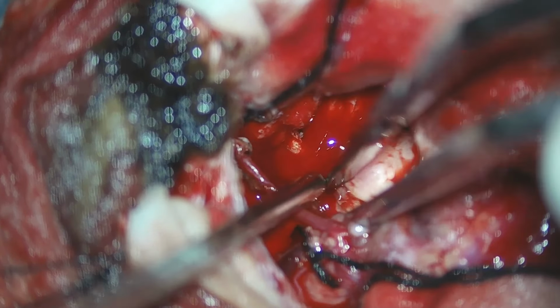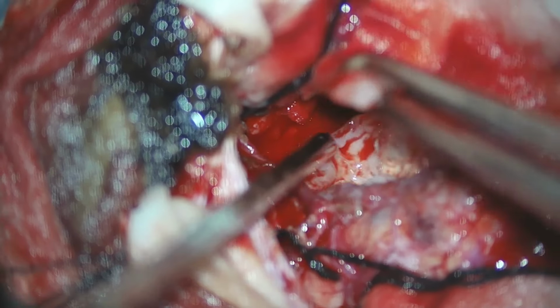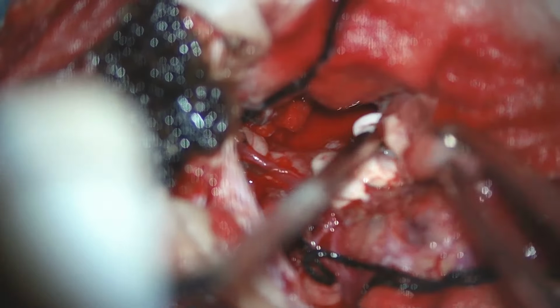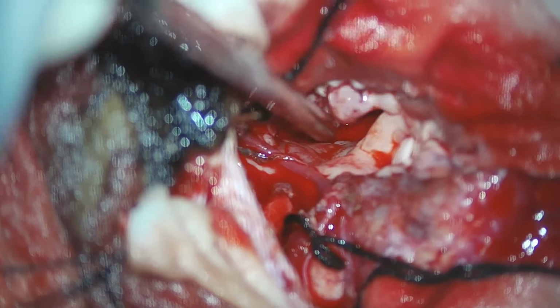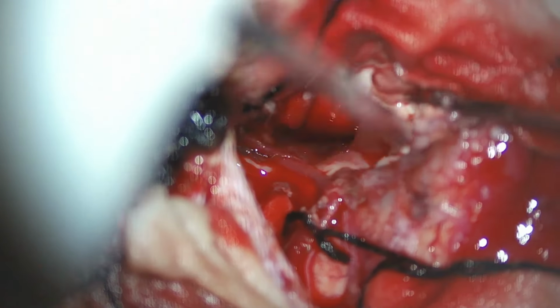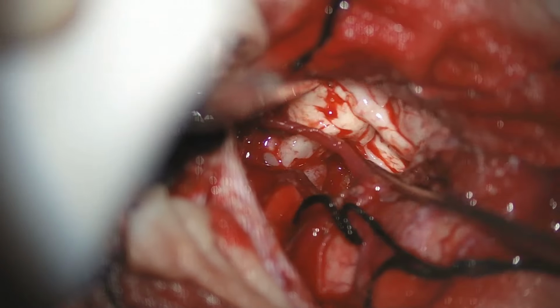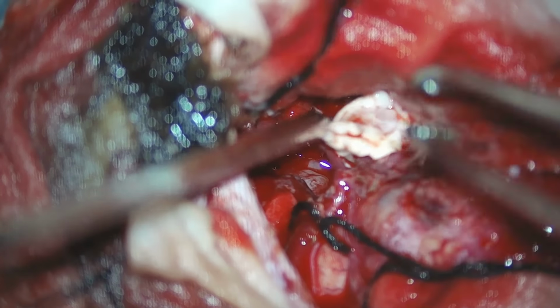We use both dissector and the tumor holding forceps along with the debrider, depending upon the need. Now we are creating a good space from the anterior aspect, a good plane between the tumor and the normal brain. Even some part of edematous brain is also being removed here.